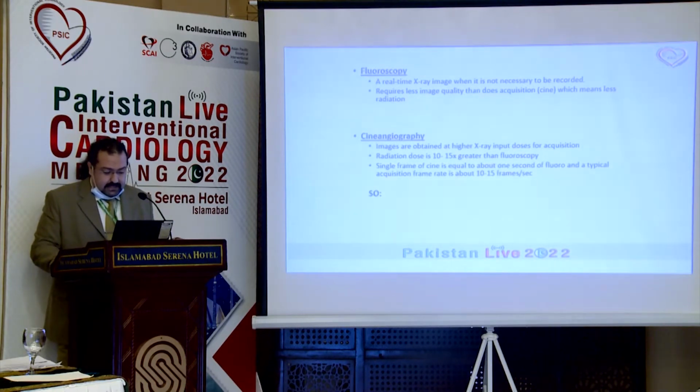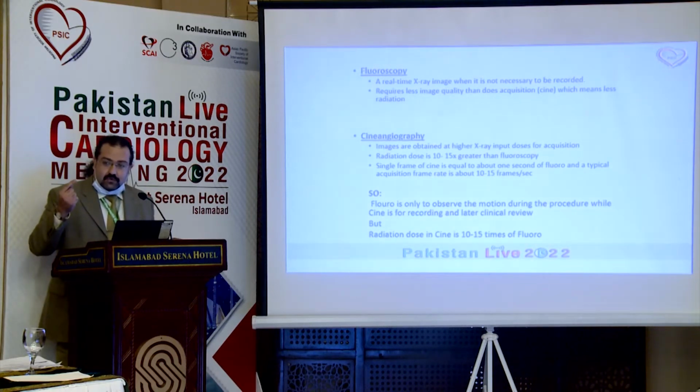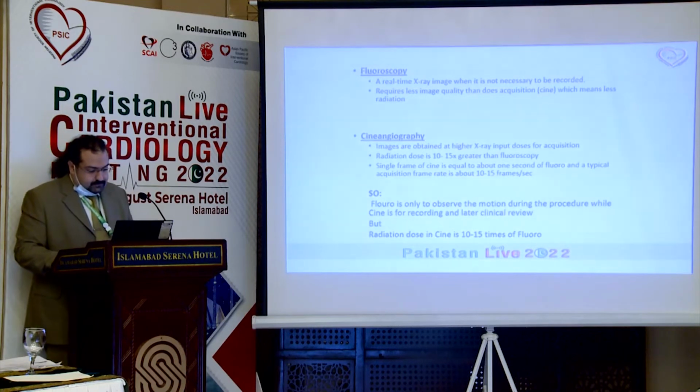So just to make it easy and simple, and to save time, I would say that 1 second of cine is going to be equal to 10 to 15 seconds of fluoroscopy, right? So you need to be very careful. So try to avoid cine as much as you can.